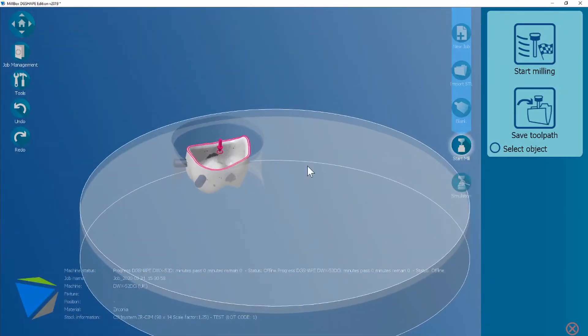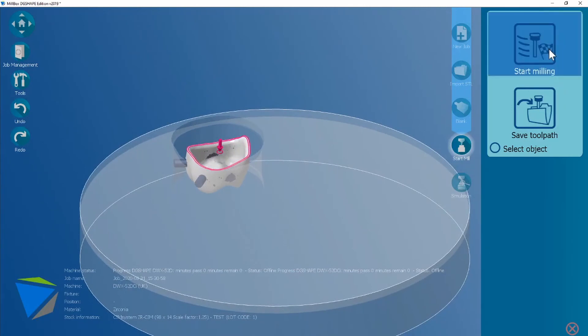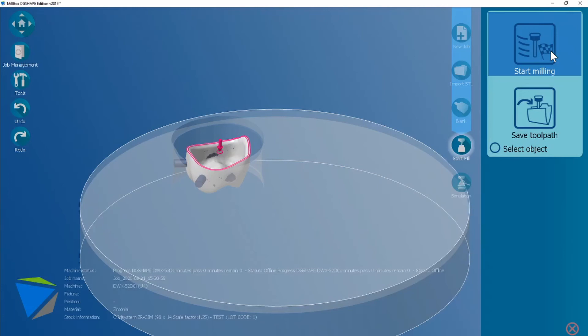Then move on to either start milling which you need the machine connected and it will stream the job five percent at a time, or you use save toolpath which today I'm going to select.